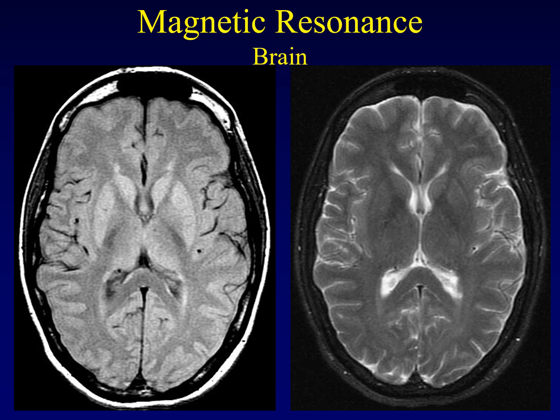Magnetic resonance imaging gives us a much broader range of ways of interrogating the tissue. Unlike a CAT scan that looks at just one aspect of the tissues, that is, how well they absorb X-rays of a particular energy, magnetic resonance imaging gives us an opportunity to hammer these tissues with a wide variety of different radiofrequency pulses in various predictable sequences. These pulse sequences define how we're looking at the brain. So we get a wide variety of different outputs when we're doing an MRI.